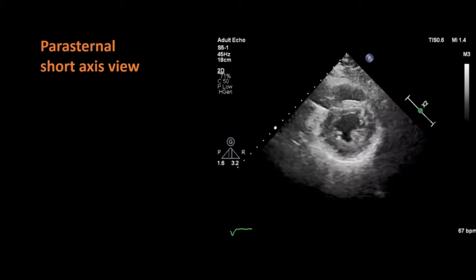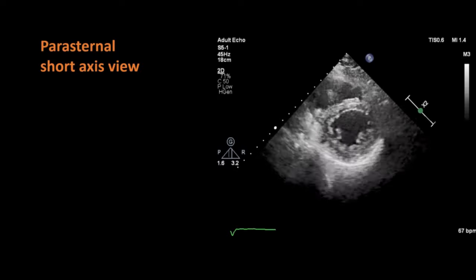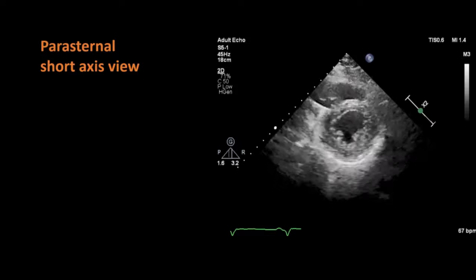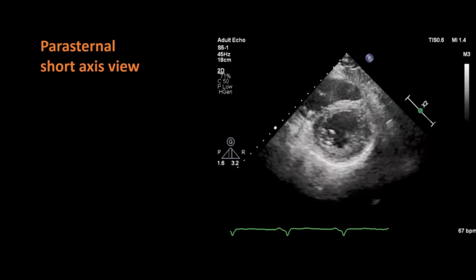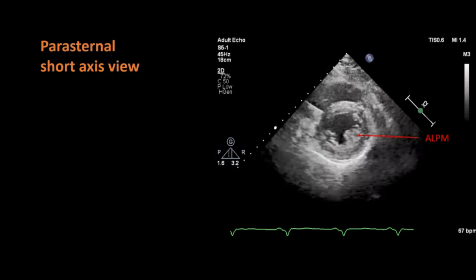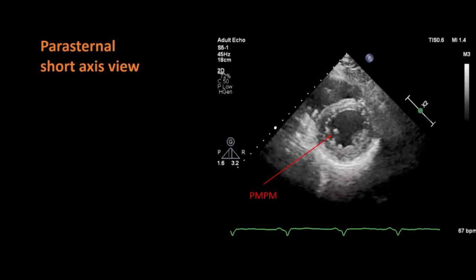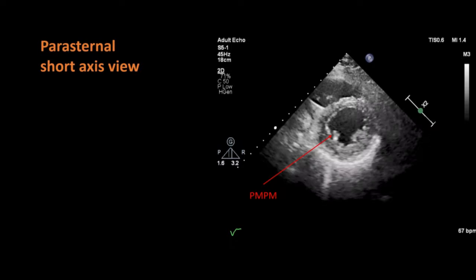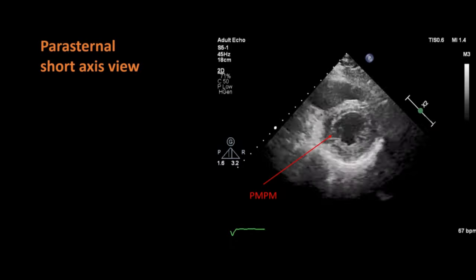This is the same short axis view of the heart but at the papillary muscle level. It is obtained by tilting the probe towards the cardiac apex from the previous position. In this view, you can see both papillary muscles of the left ventricle: the anterolateral papillary muscle and the posteromedial papillary muscle. With visual assessment, you can also comment on the left ventricular function in this view.